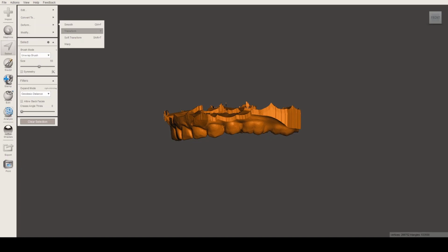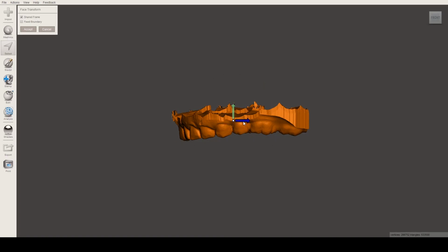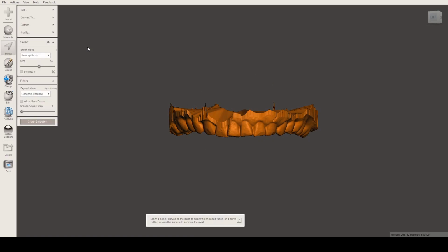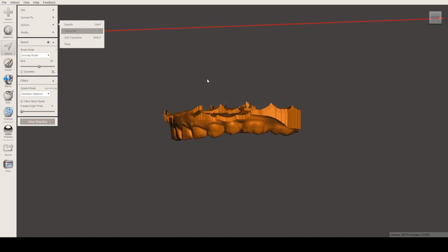Just wait for it again. Sorry guys, it's quite long. Okay. The blue button just moves it. That should be our front. So just accept. It's the dog again. And we'll re-render it. Did it make a difference? No, it didn't. Let's try it again.